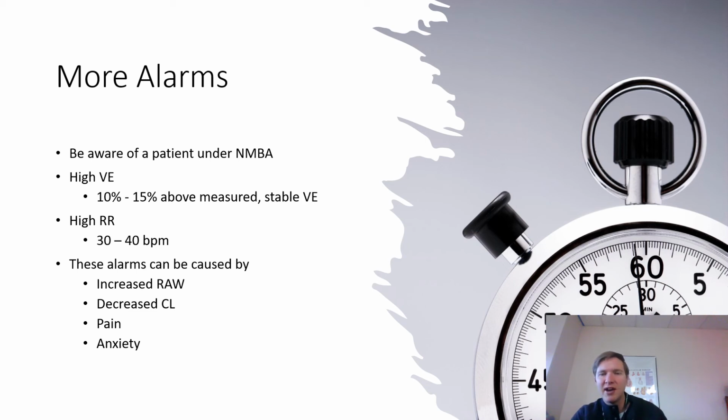And so when we paralyze, it's a great way to help us reduce how much work the patient has to do on the ventilator and how much the ventilator has to do to get gas into their bloodstream, because now they're no longer producing CO2. Their oxygen requirements decrease, right? It's not that they won't produce any CO2, they'll still be alive, right? But we're reducing the amount of CO2 production. We're reducing the amount of oxygen consumption. So once we reduce oxygen consumption, we can use lower FiO2s. Once we reduce CO2 production, we can use lower minute ventilations and still have adequate pHs, right? So that's the advantage there.